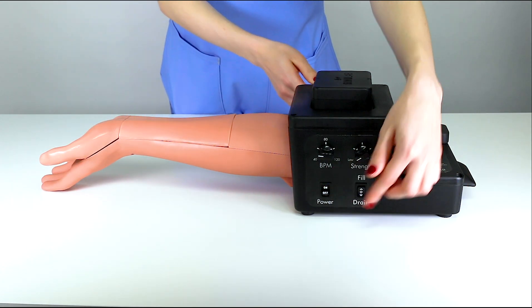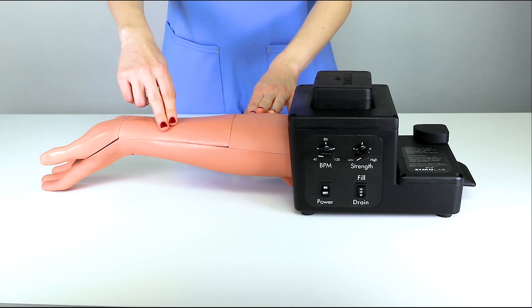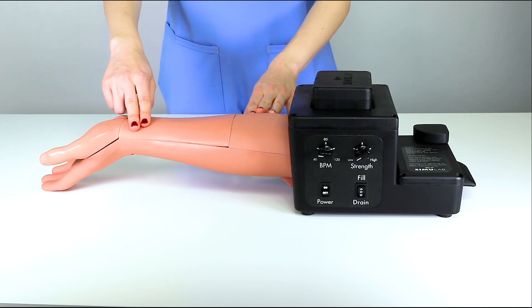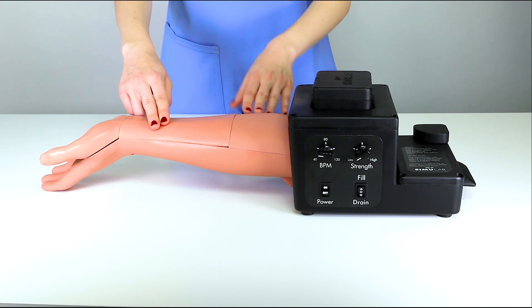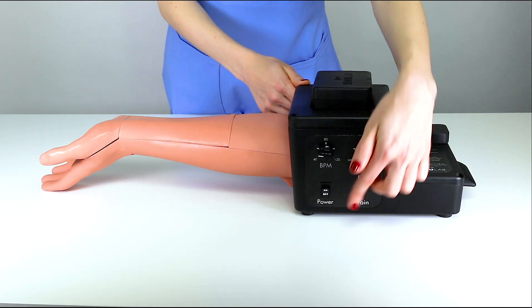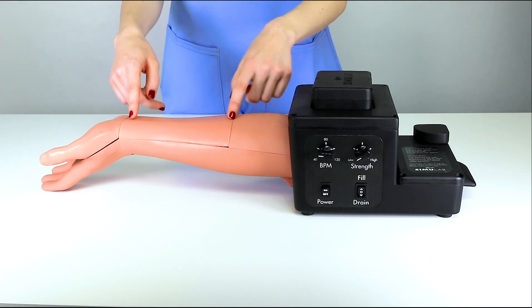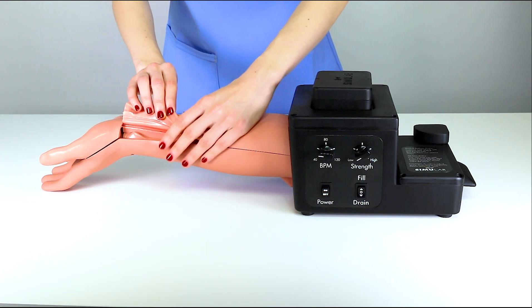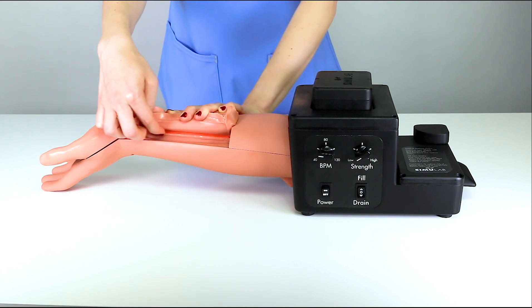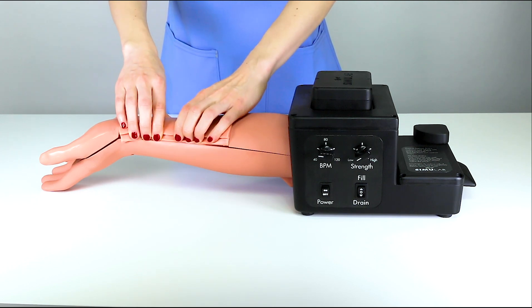If at any time during your training you have difficulty finding the radial pulse, check to ensure the artery is properly placed in the tissue channel. To do this, first turn the trainer off. This will ensure that there is no fluid spray when you expose the artery. Lift the lateral section of the tissue and check that the artery is properly tucked into the tissue channel. Replace the tissue and power the system back on.